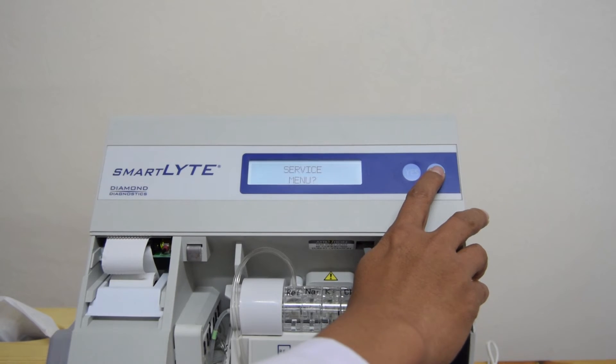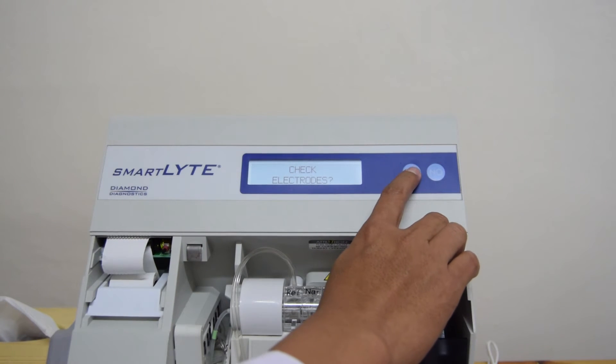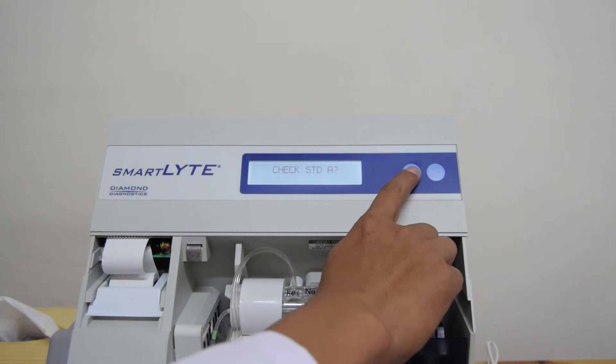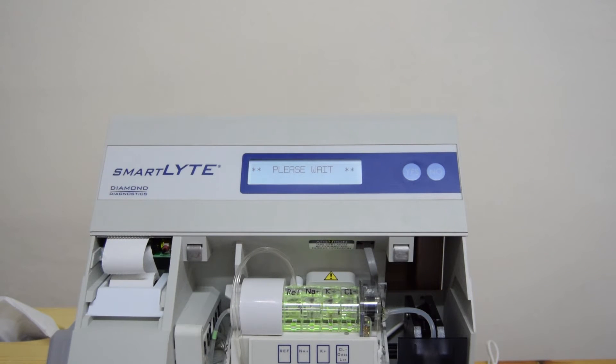Service menu, yes. Check elektroder, yes. Check standar A, yes. Standar A sudah selesai dan nilainya keluar. Nilai-nilai ini, nilai standar A, B, atau C itu ada pada user manual untuk membandingkan angka-angka ini sudah benar atau belum.